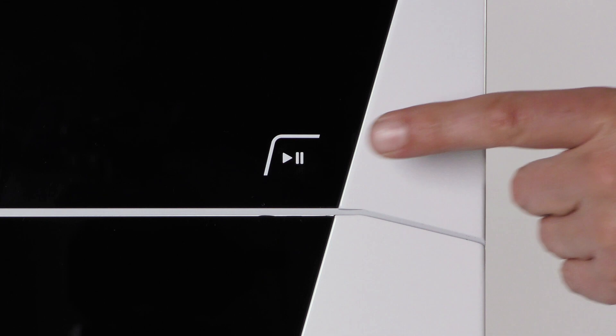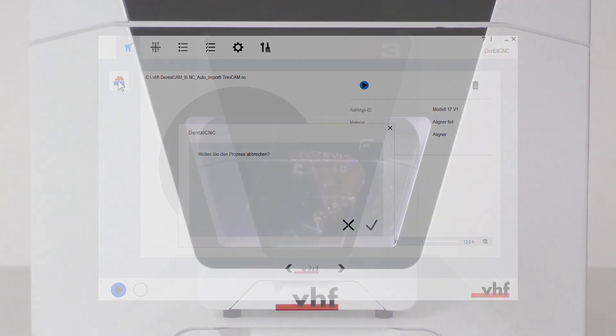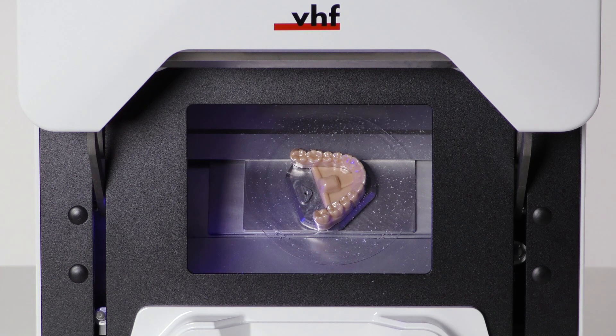To pause the job, press the start button. Alternatively, pause the job via dental CNC. You can open the working chamber door to inspect the blank. However, leave the blank on the blank holder because otherwise the machine won't be able to properly continue machining.